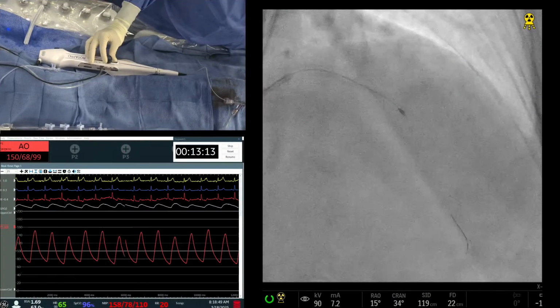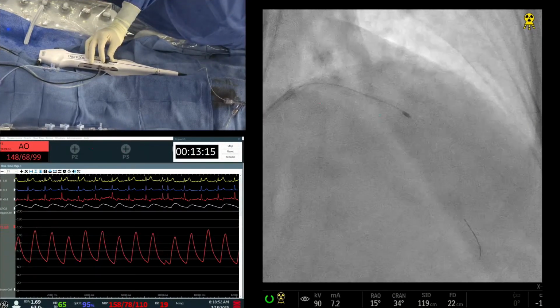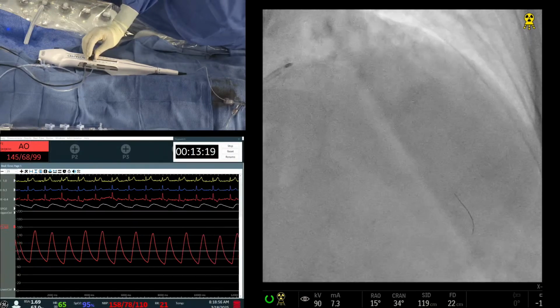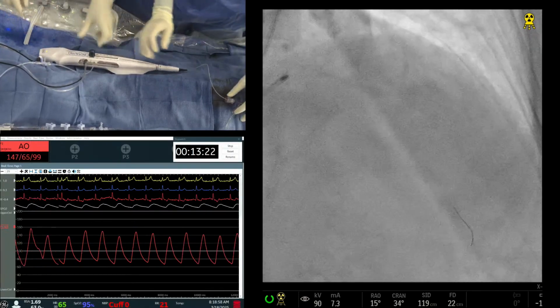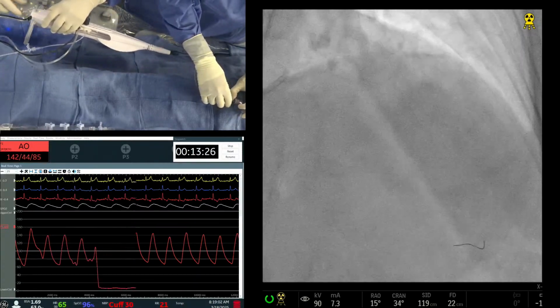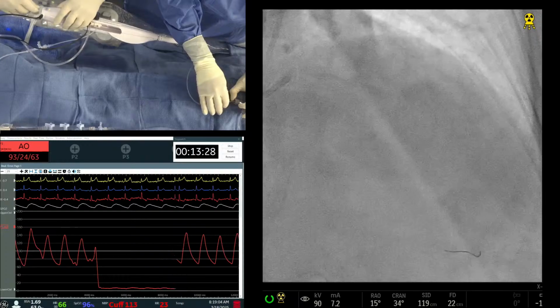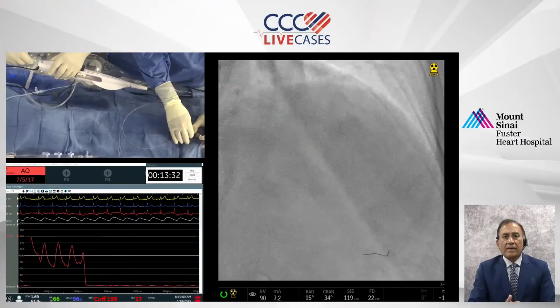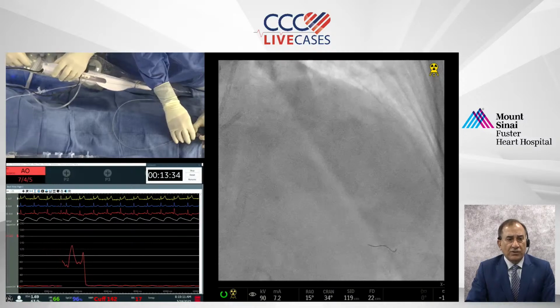Applause for having explained this technique and the rationale behind doing it. Thank you all and continue to follow as we possibly take the next step. We'll help you with the imaging guidance and the decision whether there is a D1 additional rota or lithotripsy here.